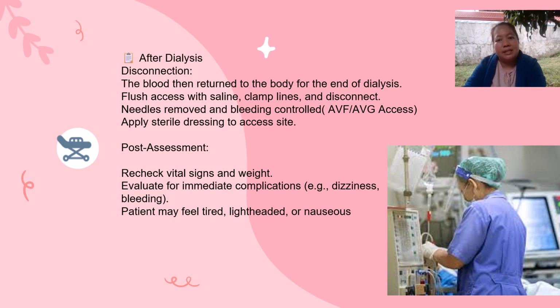For post-assessment, recheck vital signs and weight for us to have a basis for the next dialysis. Evaluate for immediate complications, for example, dizziness, bleeding. Let them relax for a while first before walking out of the center. The patient may feel tired, lightheaded, or nauseous, so check on them all the time, even when they are done.